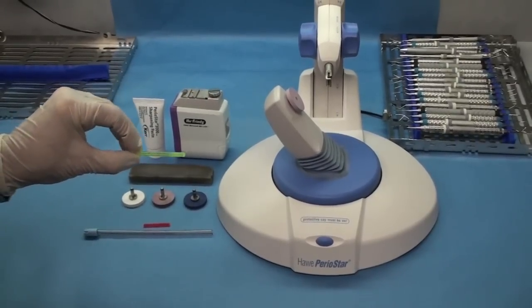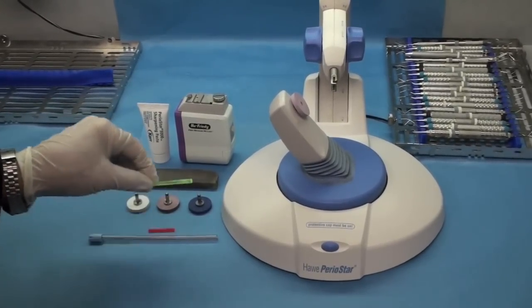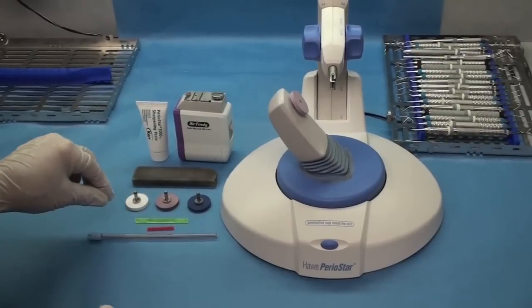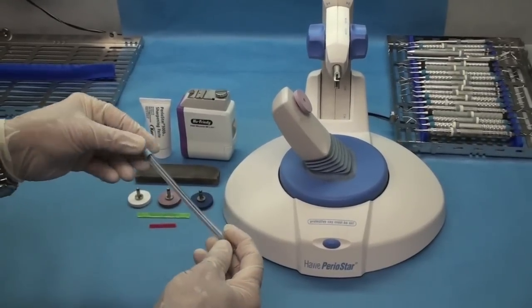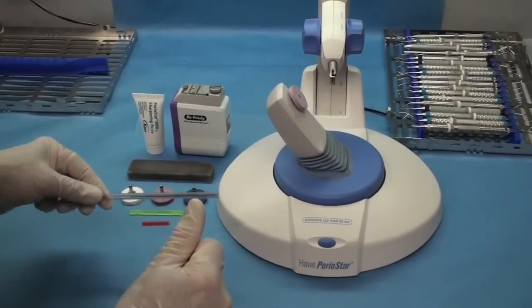This is the instrument test stick that comes with the Periostar. To tell you the truth, I mean they wear out, they get notches in them, and they're not as good for checking because we use it so much. So I really like either a saliva ejector or a high speed evacuator tip. I like these better.